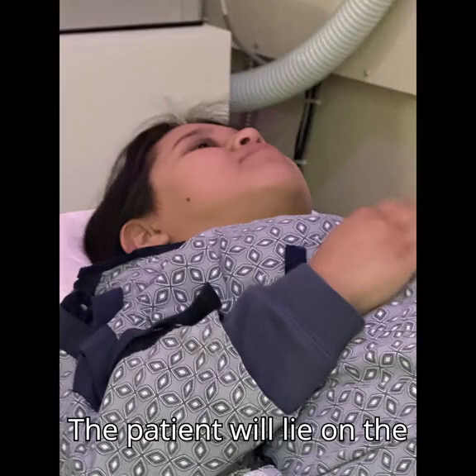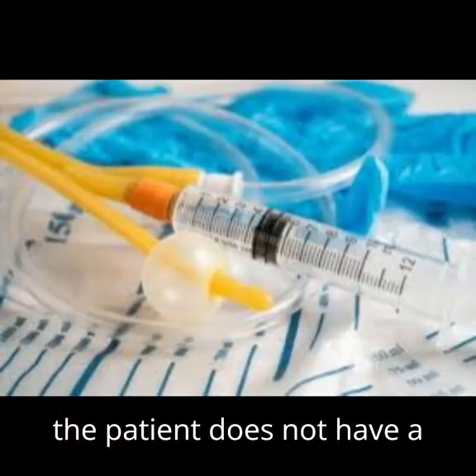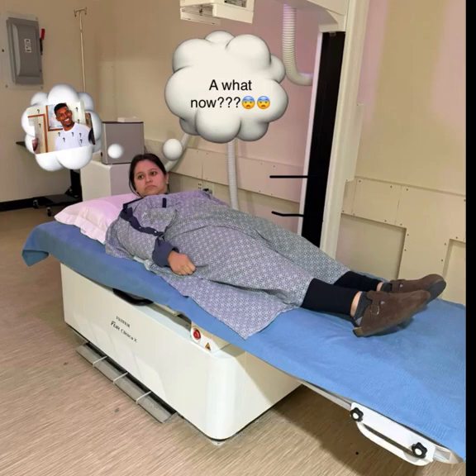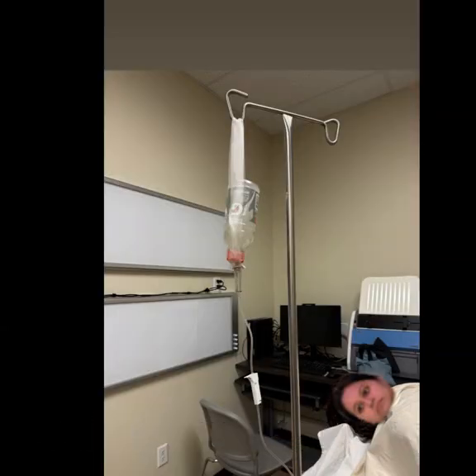The patient will lie on the table and a scout image will be obtained. If the patient does not have a catheter, one will be inserted under sterile conditions using the Foley catheter tray. Tubing will be connected from the Foley catheter to the contrast media.